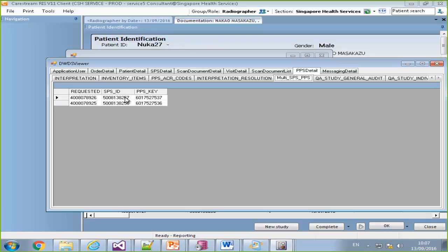Do you have a question about this skip? I see in the document that there are fields that are not included in the copy. Yeah, right. I forgot to tell you about fields that we create, like custom fields at PPS level. It will be copied. We have a list. It's written in the documentation.